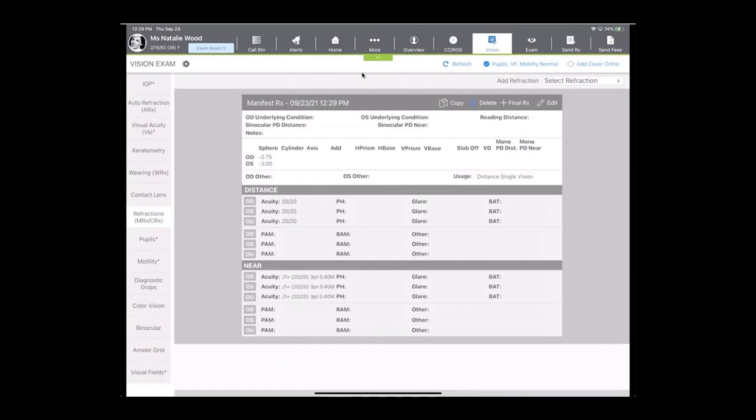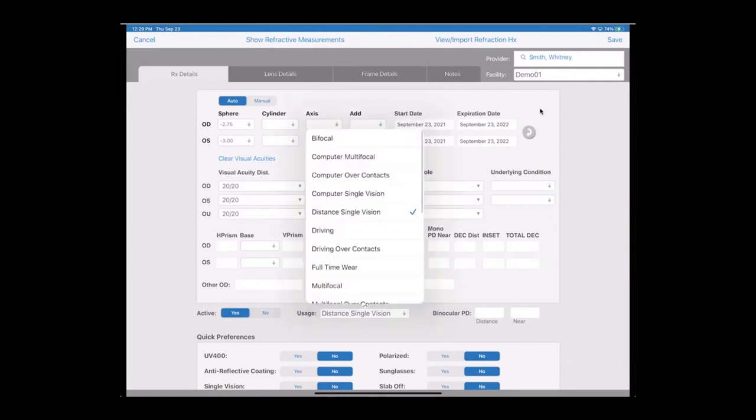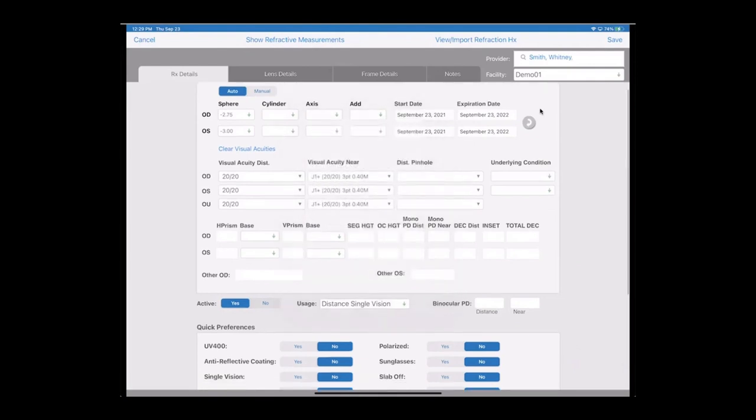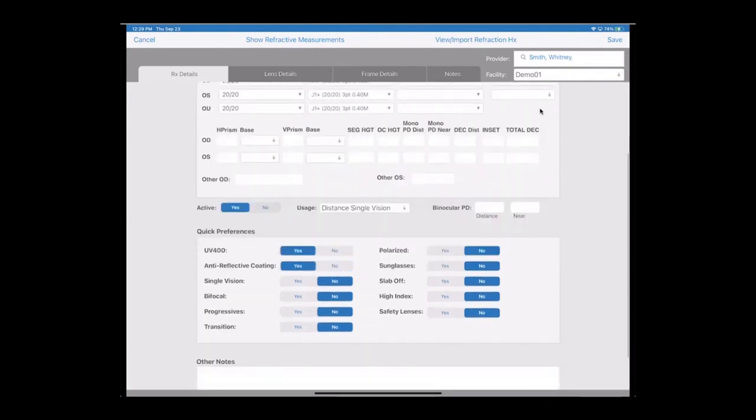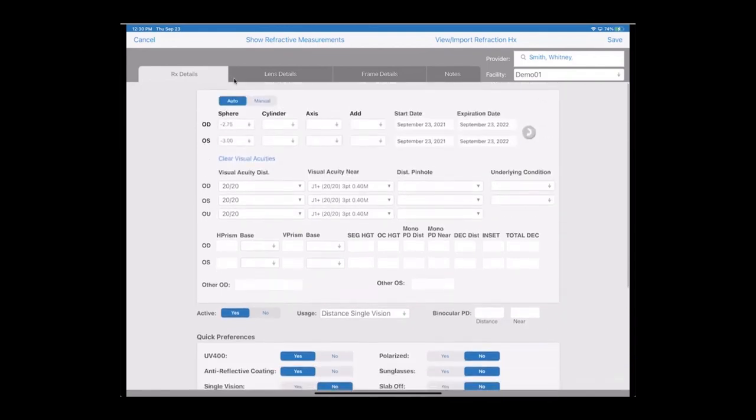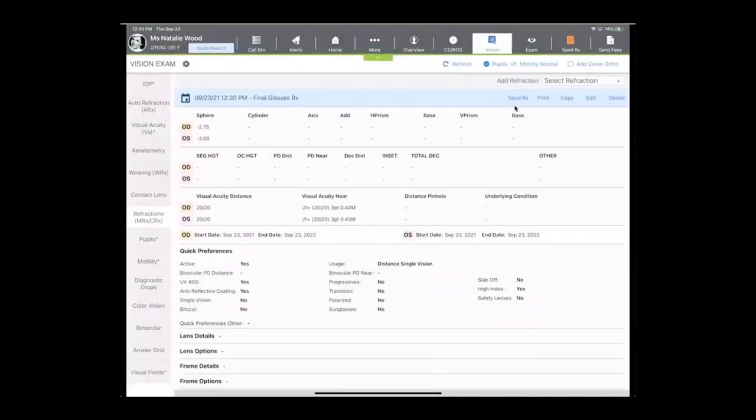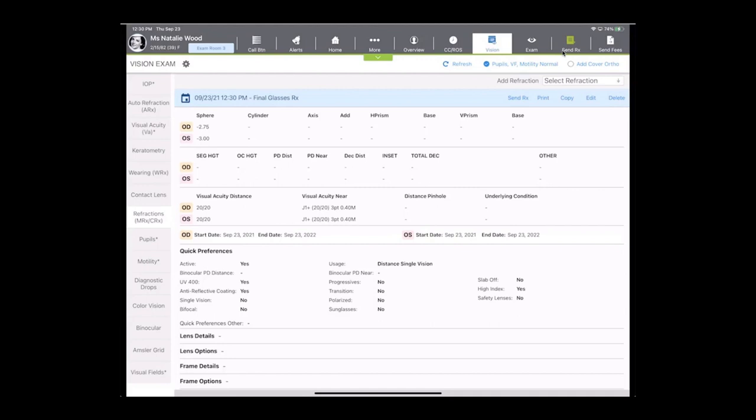And very quickly, we just can click on the final RX button to finalize our visit for today, notate a usage, make any recommendations we would like down here at the bottom, or specific lens and specific frame recommendations. Once we have that finalized, we can do a few different things here on the iPad. We can send this prescription right over to the practice management system, and you'll see that our little send RX button is orange. When I tap on that, it will send it and also turn that button green to let us know that it has been sent.